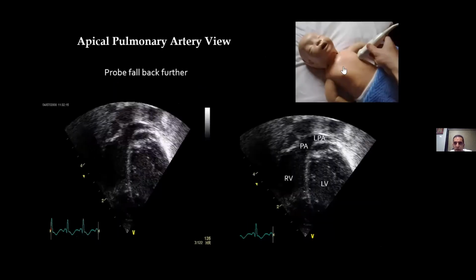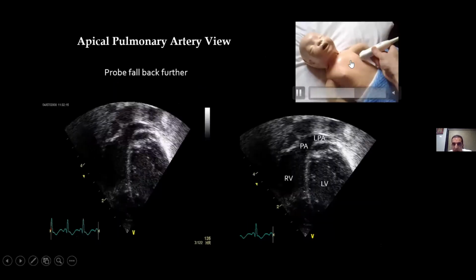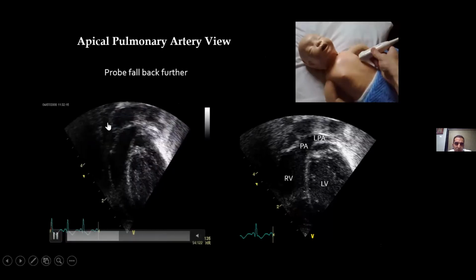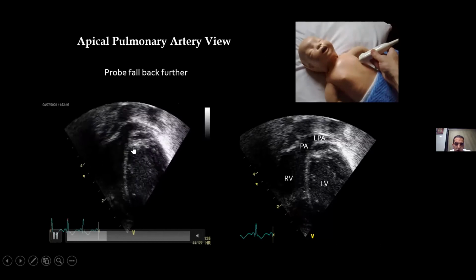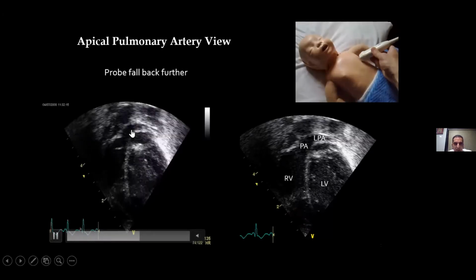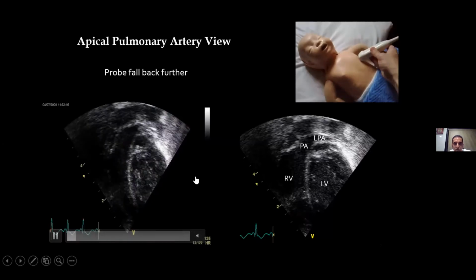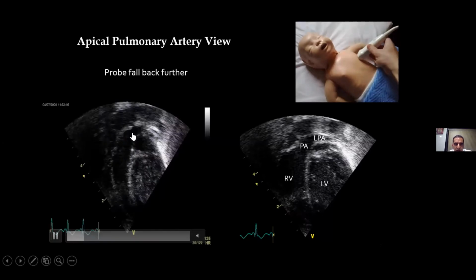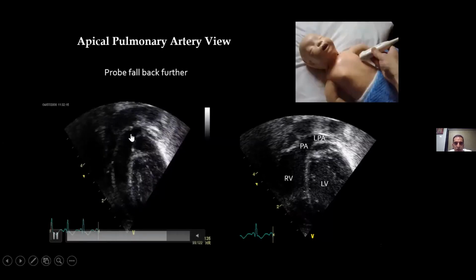And when you sweep it further up anteriorly, as it has been told, you will see the aorta, which was like this, is gone, and you start seeing another vessel overlapping that at right angle to that. So that crisscrossing is there. So that rules out, so this is what? This is your pulmonary artery. It is anterior to your aorta.